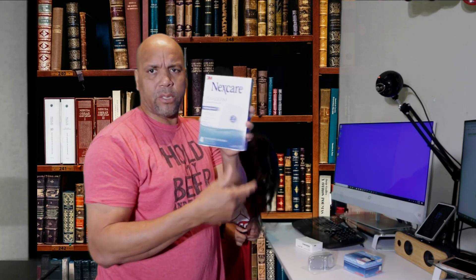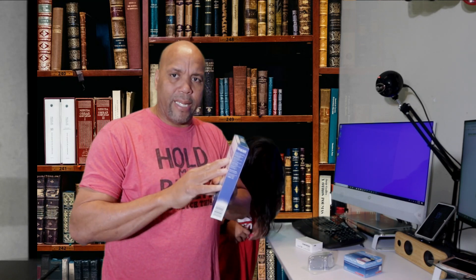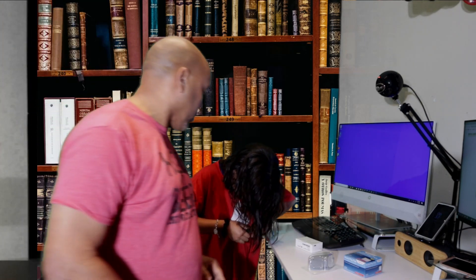I also went and got some wipes to clean the area where you're going to use it, and I got these waterproof barriers. I ordered some from Amazon that come with holes already cut out — these ones don't have holes, but my plan is to keep it on there to try to get more days out of it. Some people get up to 20 days on a sensor, so we're going to try that.